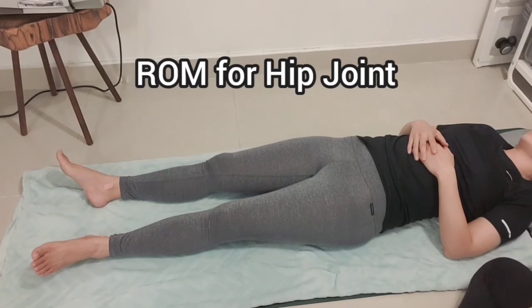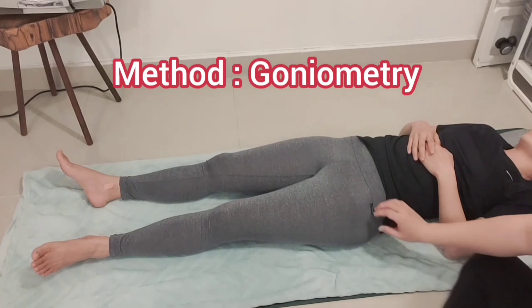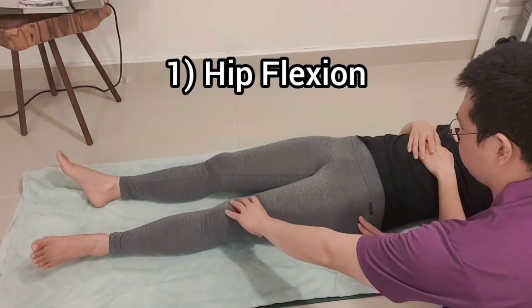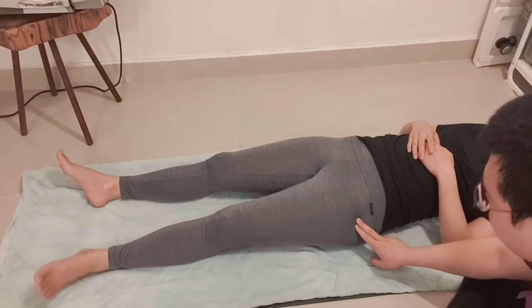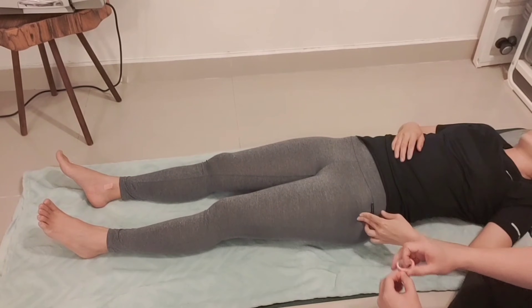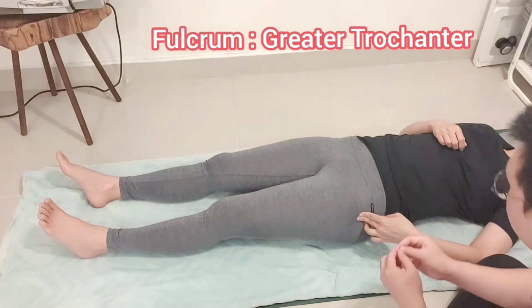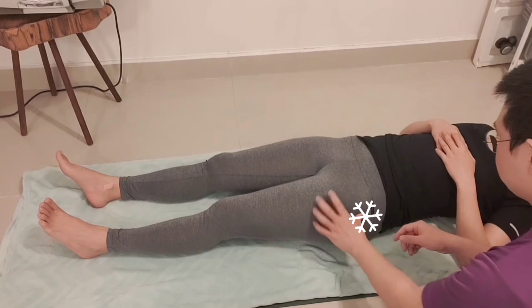Now I will perform range of motion for the hip joint through the goniometer. Number one: range of motion of hip flexion. I'm trying to externally and internally rotate the hip joint because it makes it easier to palpate the greater trochanter, and this greater trochanter is going to be the fulcrum of the range of motion hip flexion.